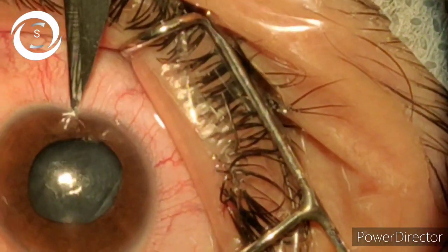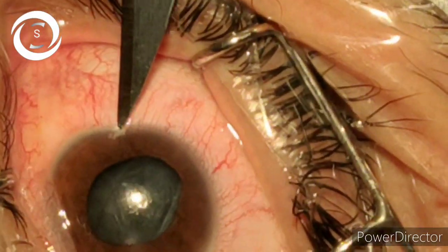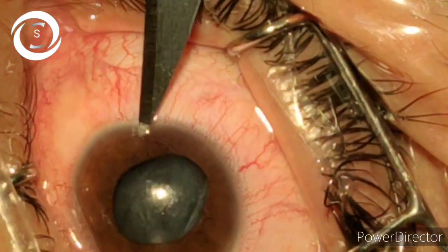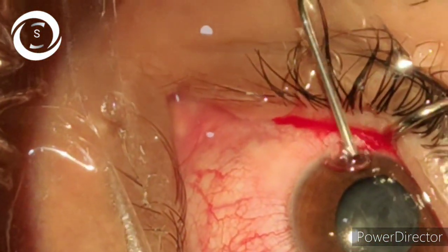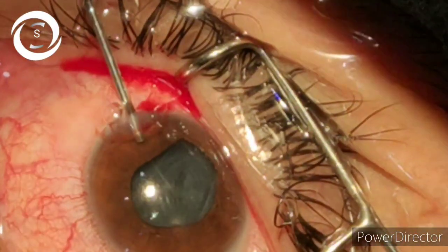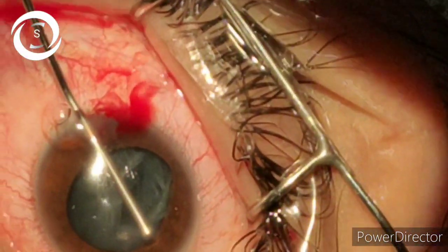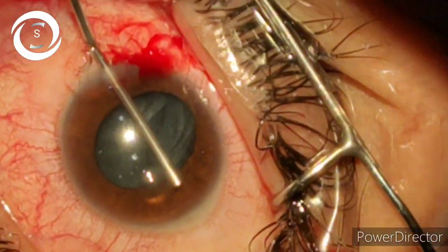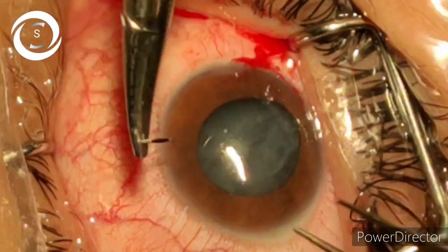I immediately shifted the patient to OT, gave him 2.5 ml peribulbar local anesthetic and now repairing it. After painting and draping I made a side port. Now injecting the viscoelastic to form the anterior chamber and keep the distance between the cornea and ruptured anterior capsule.